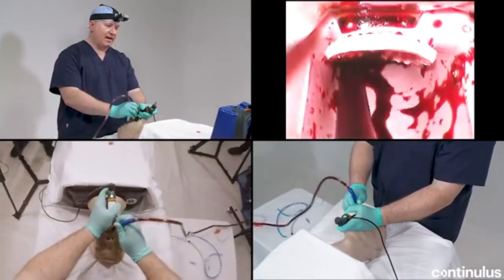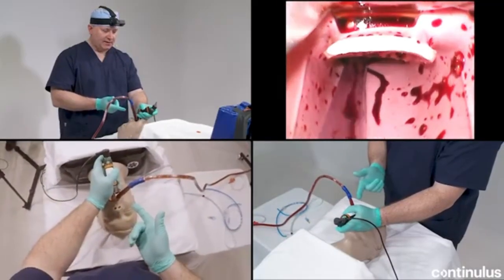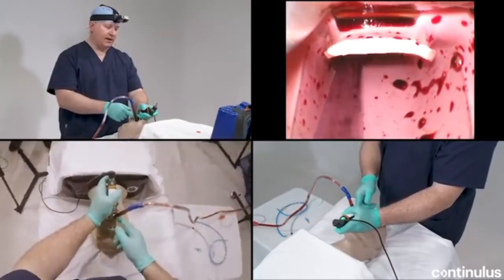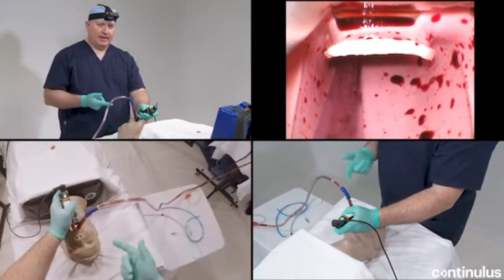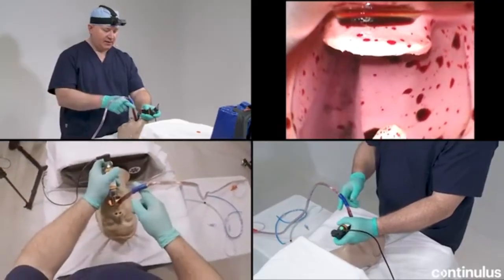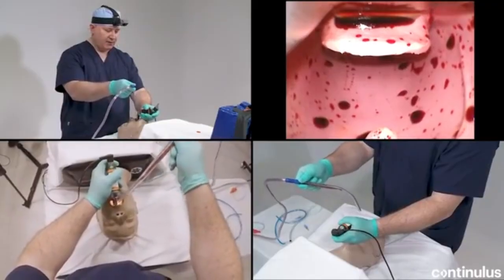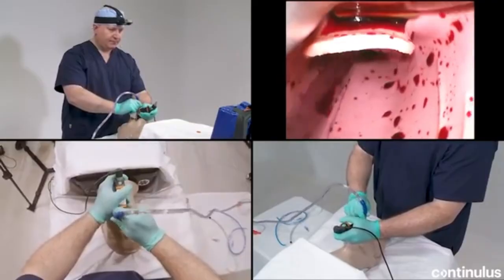So how am I to manage this? If I leave the suction catheter on the right side of the laryngoscope, it's going to produce a problem where I now have difficulty of tracheal tube delivery. How am I going to leave the suction catheter in the mouth while I do tracheal tube delivery? There's 2 sides to the blade. I'm going to take advantage of the left side of the laryngoscope blade. I'm going to remove the catheter and place it down the left margin of the laryngoscope blade.